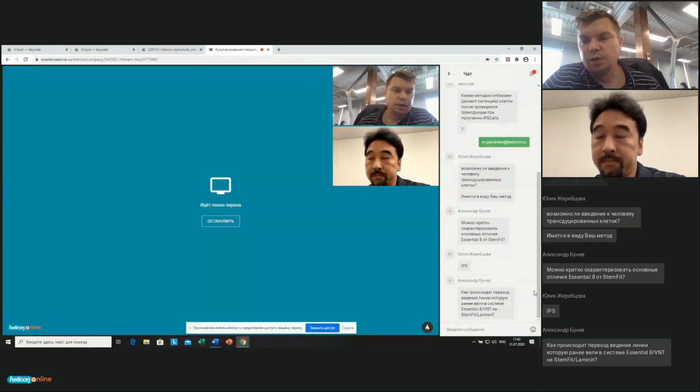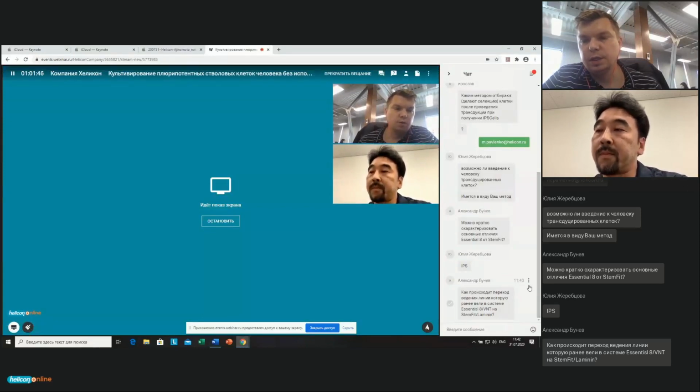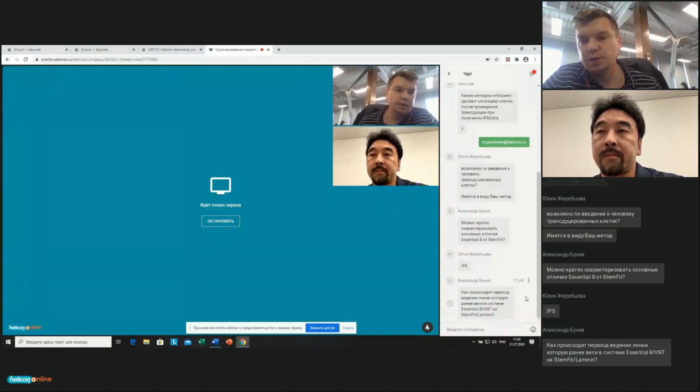Да, насколько я понял, можно легко перевести клетки на среду StemFit. Значит, при пересеве вы сеете клетки, как вы раньше их сеяли, на среде Essential 8 одиночными клетками, и через 24 часа вы заменяете всю питательную среду на питательную среду StemFit.